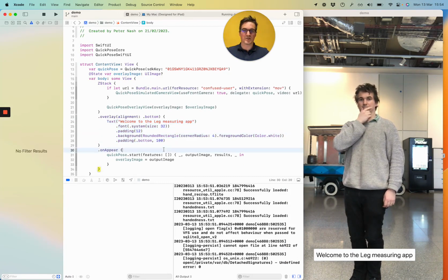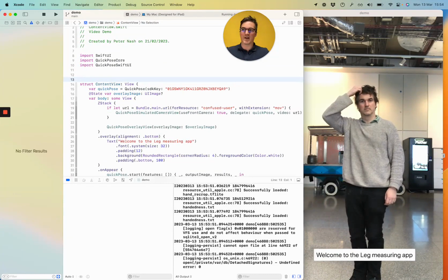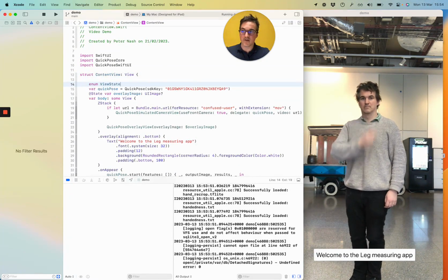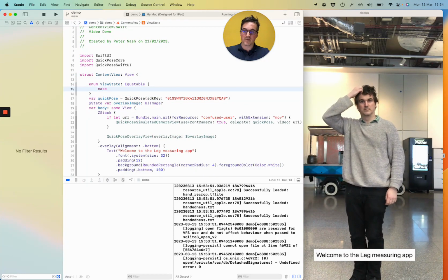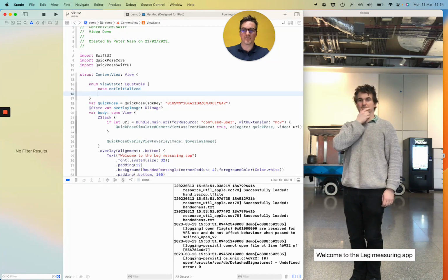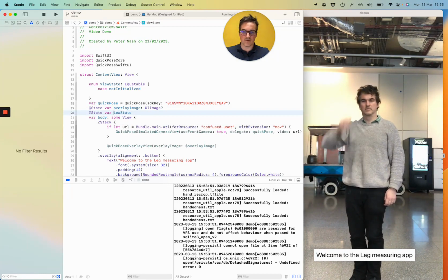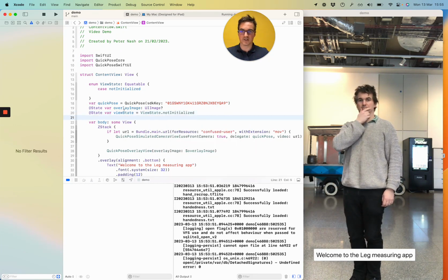We kind of want a sort of an idea of a state to transition from where we are to where we're going. And I'm a big fan of having a view state defined for the view, and I'd like to make that an enum. So I'm going to go in here with a view state. I'm going to make it equatable so we can do some interesting stuff with it. So my first case would be not initialized. I can use an optional version of this, but it makes the view a bit more cluttered. So for now, I'm just going to have a not initialized state. Cool, we've got a view state, and it is immediately instantiated as not initialized.